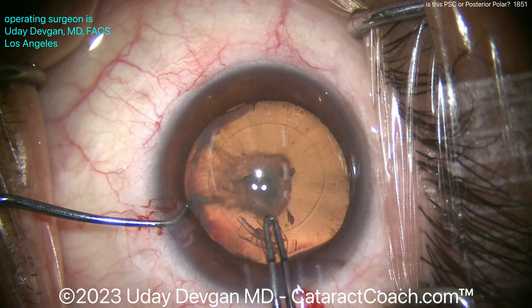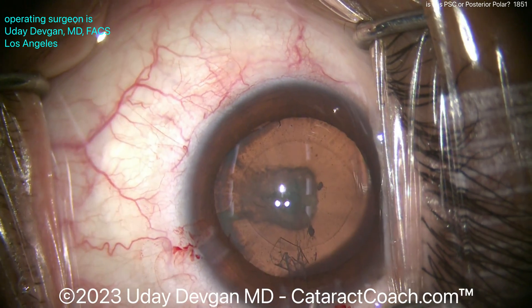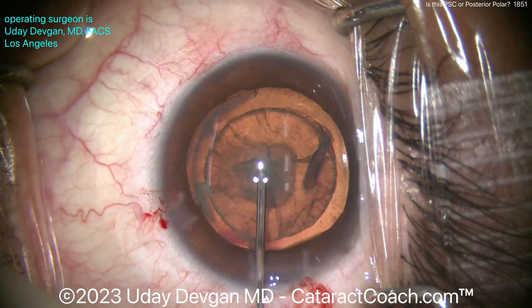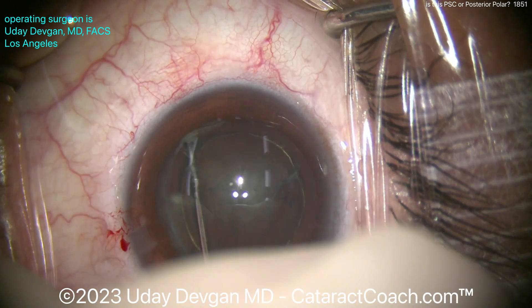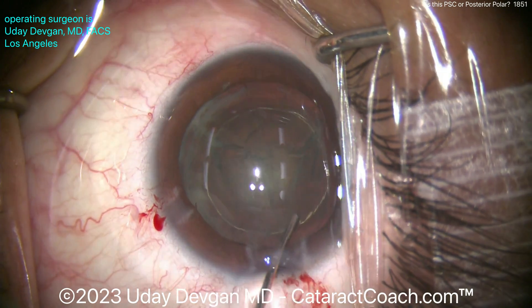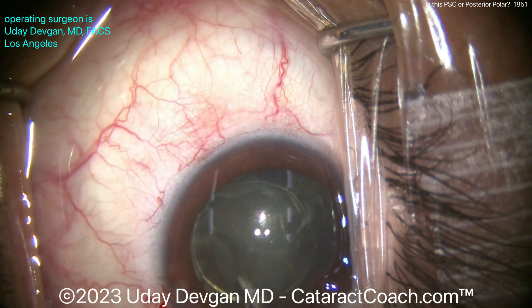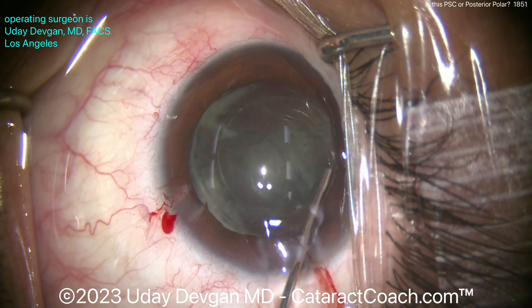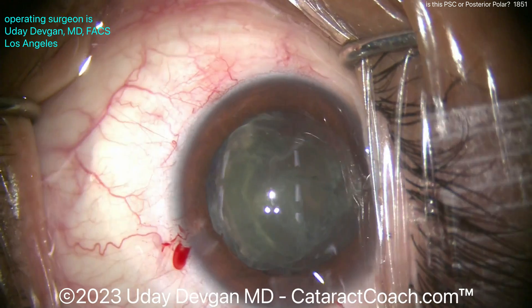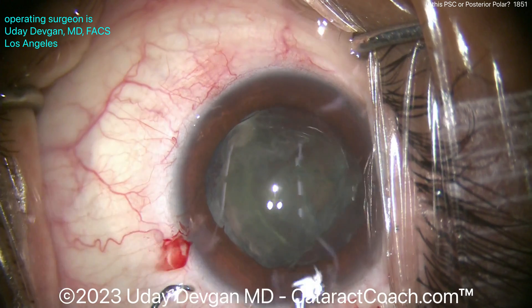Finishing this case up — with the 5mm rhexis done, do you do hydrodissection or not? As you know, Osher and Basavra have published studies showing that if you do a hydrodissection in posterior polar cases, a lot of times you're going to break the capsule. So here I'm just going to try to do a hydrodelineation — get that endonucleus up. I'm going to treat this like a posterior polar. Luckily, it's not a real dense cataract. So I did a hydrodelineation, but no real hydrodissection.